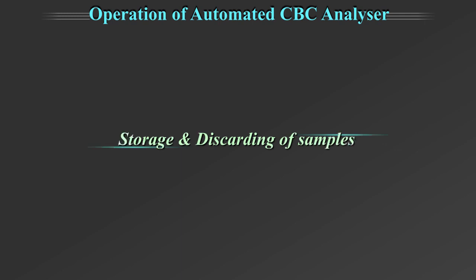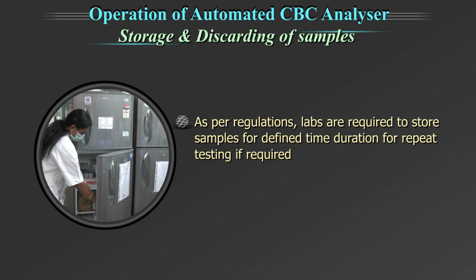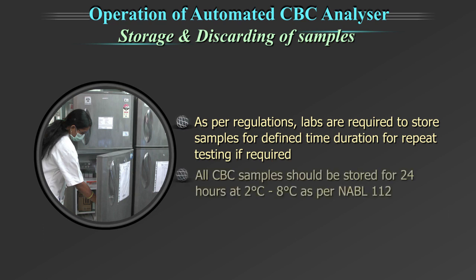Storage and discarding of samples. As per regulations, labs are required to store samples for a defined time duration for repeat testing if required. All CBC samples should be stored for 24 hours at 2 to 8 degrees centigrade as per the NABL 112.